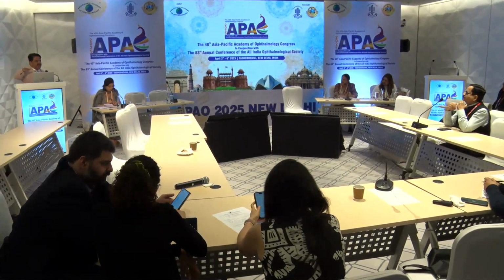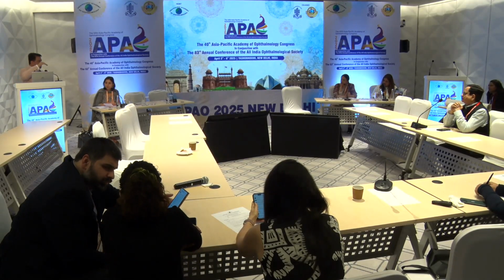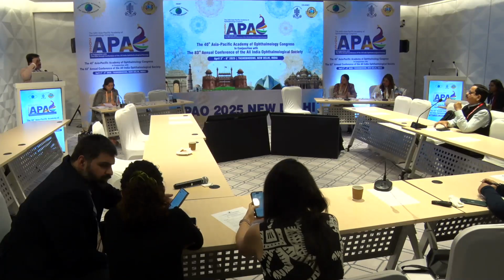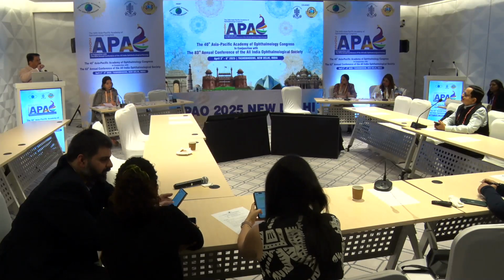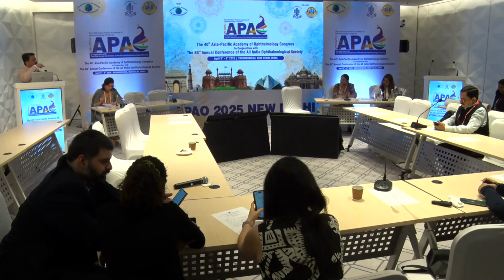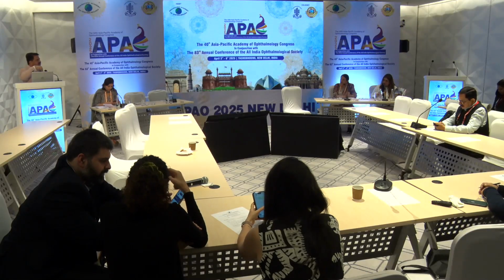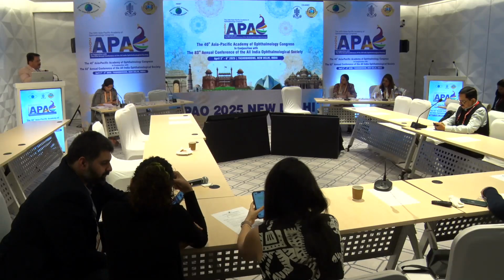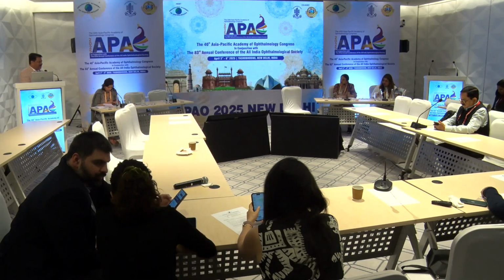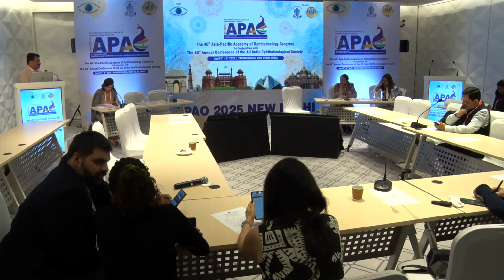As we dissect the femtolaser air bubbles, the outside atmospheric air bubble will enter inside. Many times what happens in a thin lenticule or when you have opaque air bubbles, you will not know whether you are entering anterior to the lenticule or posterior to the lenticule. Thinking that you are entering anterior to the lenticule, actually by mistake you can go posteriorly, then it's a little difficult situation. Then these signs will help. So this is the only hitch in SMILE surgery, which we try to address, so that it is the last thing which can be treated well, and then it's the safest procedure now.